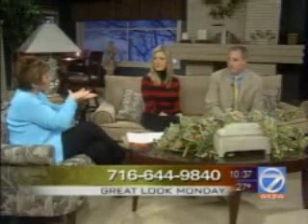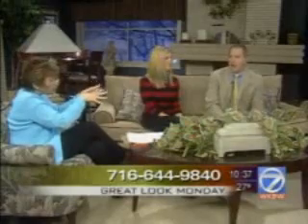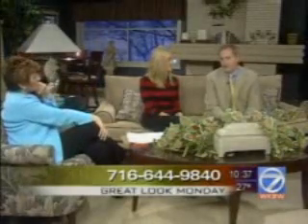Is there an age that would be good and older, or do you do this on very young people? The rule of thumb is that all of the teeth should be erupted and in the mouth. So typically around 15 years of age would be the cutoff. If your permanent teeth are all in your mouth, usually about 15 years of age you can do this. Sometimes we can do 14 or 13, but usually 15 is the right age.